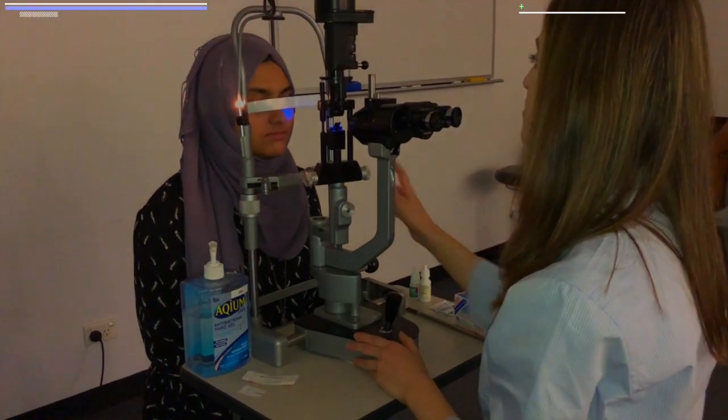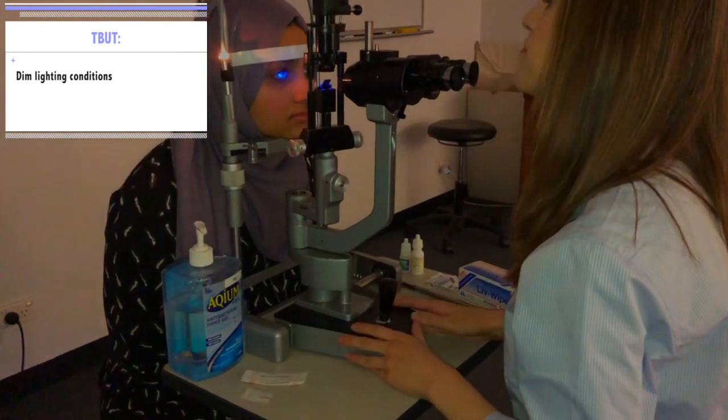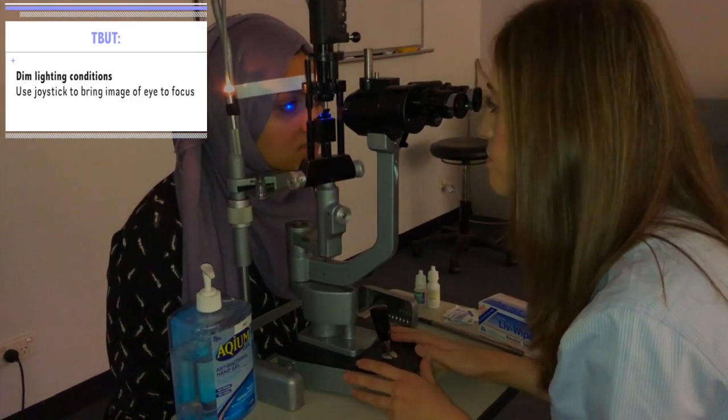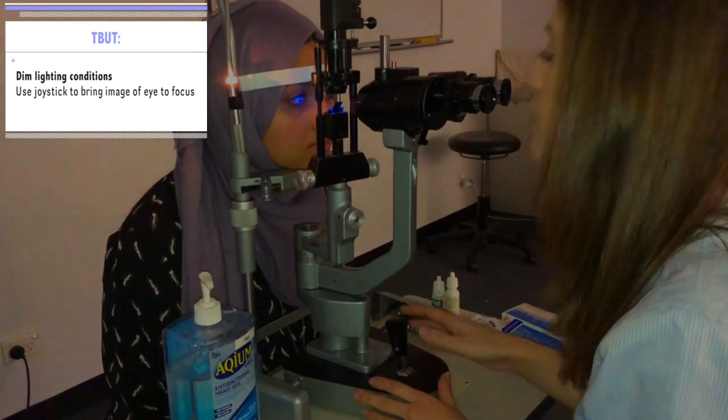The TBUT should be performed in dim lighting conditions. The patient should be instructed to fixate on the examiner's ear directly in front of their eye. The beam should be positioned to illuminate the patient's whole cornea by moving the joystick forwards and backwards, whilst rotating to adjust the height until the image of the eye is in sharp focus.